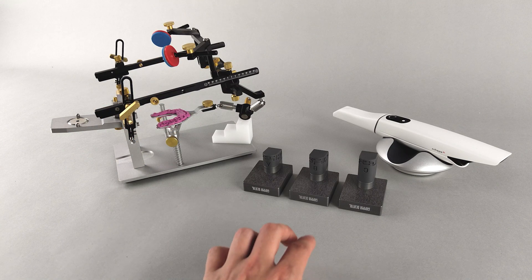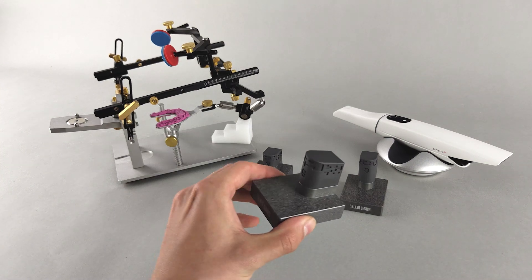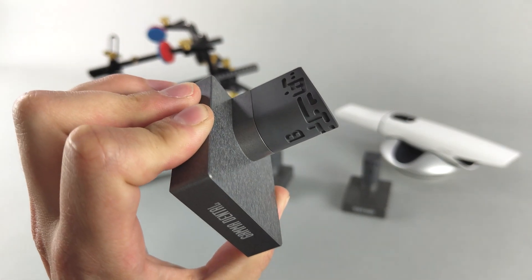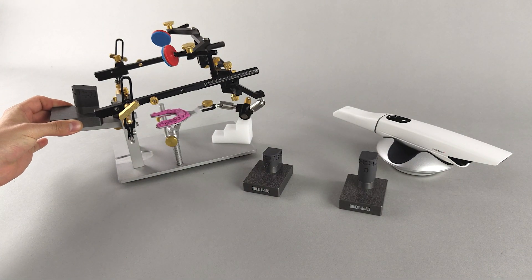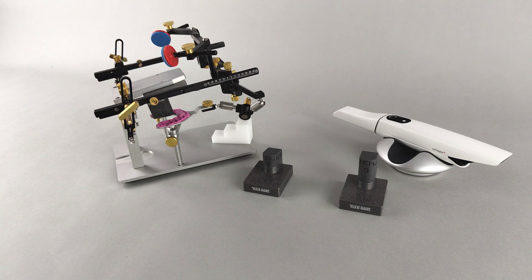A digital transfer block of the appropriate height is selected and mounted in place of the upper jaw model. As the measurement area of typical intraoral scanners is relatively small, a large gap between the bite fork and the transfer block may result in the scanner failing to connect the two surfaces into one continuous scan. It is therefore recommended to fill this gap with soft and malleable bite registration material.